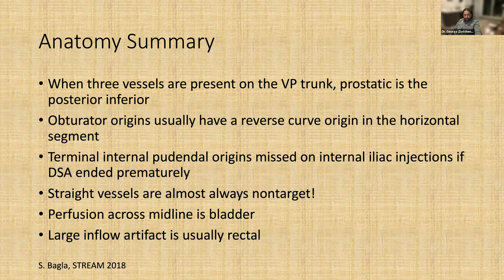And if there's a large inflow artifact, it's usually from the rectum because the rectum has supply from the inferior mesenteric artery. So you can have blood coming from the inferior mesenteric artery, which is causing flow artifact on your angiogram. So beware of that. And one thing I should add, what I kept saying is a crossing obturator sign, that's not on here.